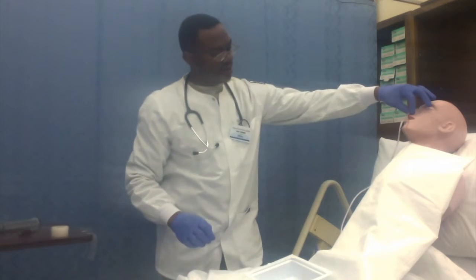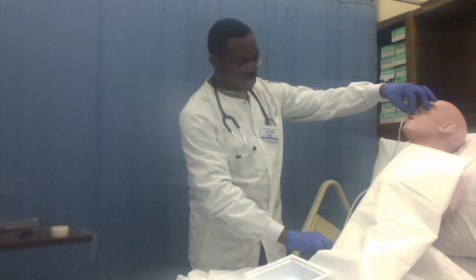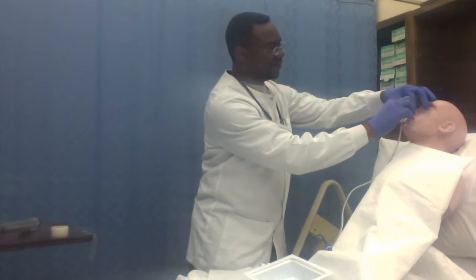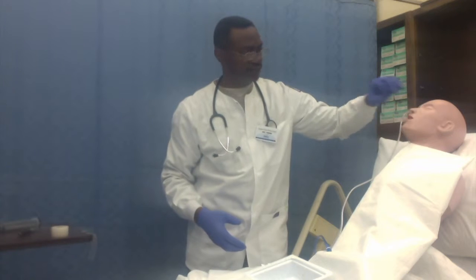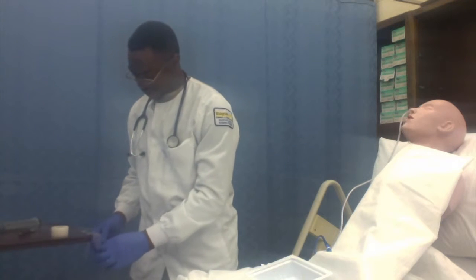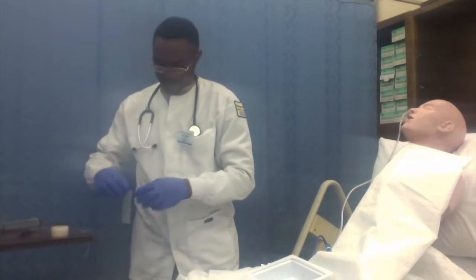Good. Now, the tube has been inserted right to the mark. I will now proceed to secure my tube in place. Take my tape.